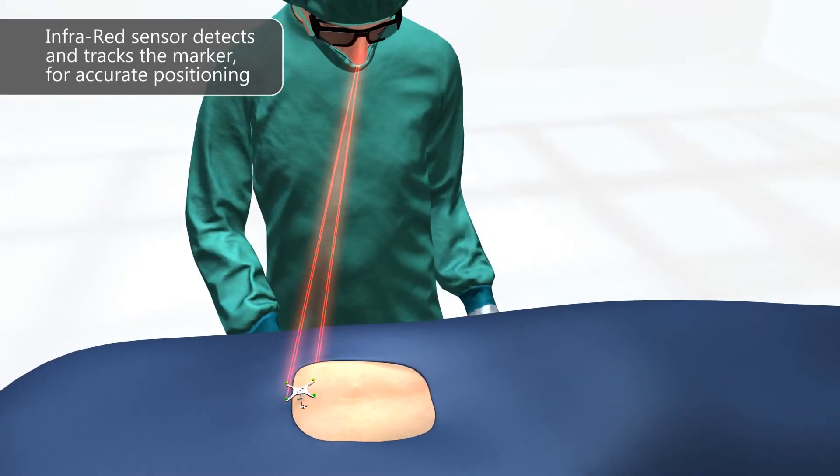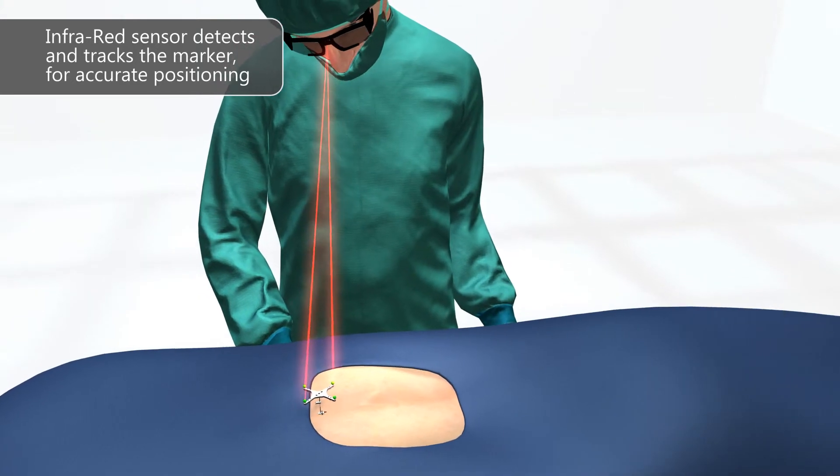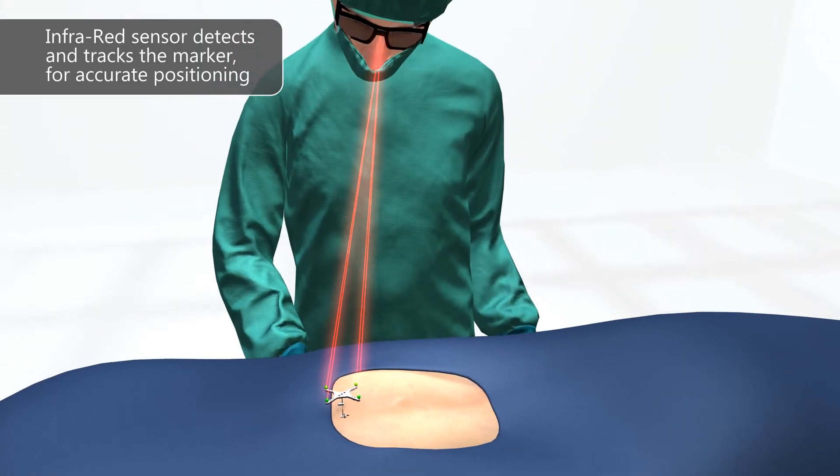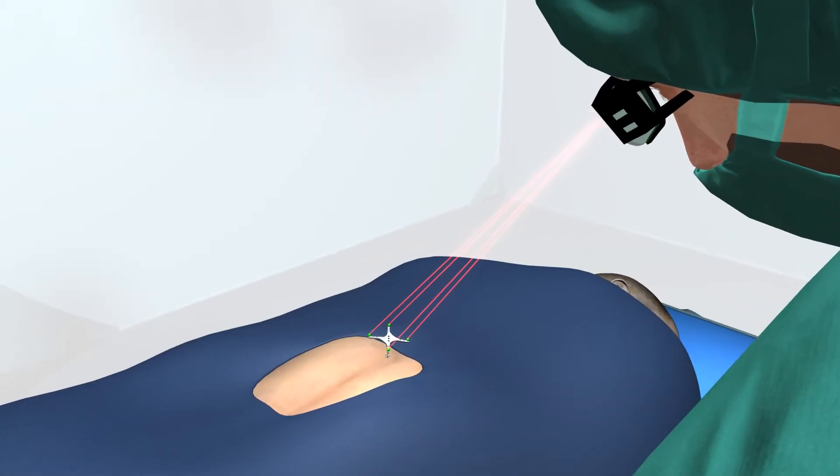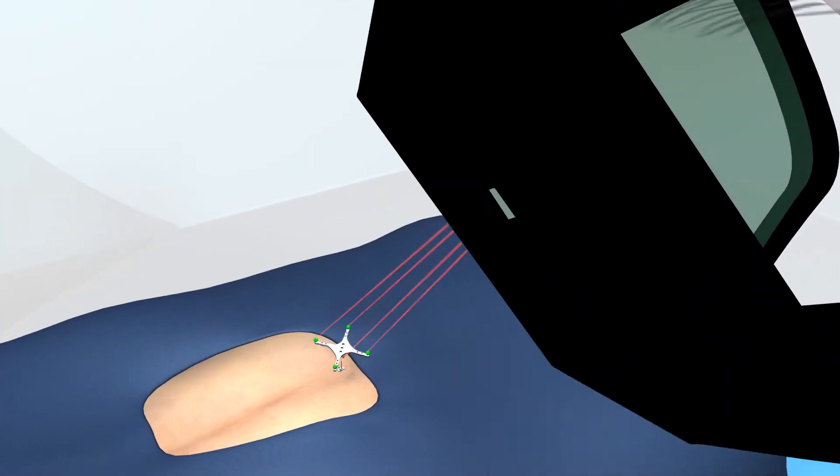The infrared sensor on the visor detects and tracks the marker and determines the position of the surgeon's head. Using our patent-pending technology, the visor projects in real time the patient's 3D spine onto the surgeon's retina.